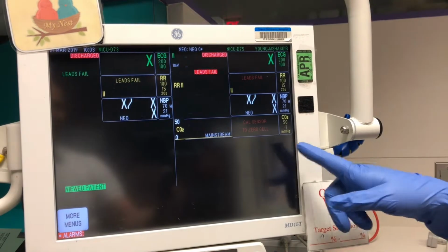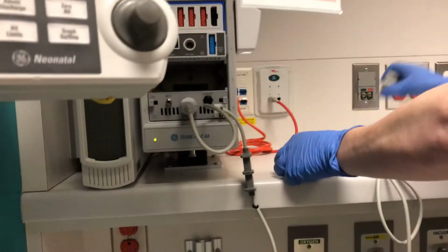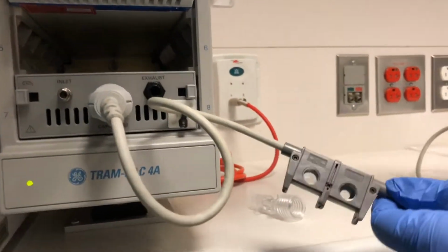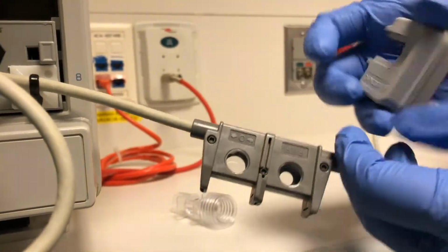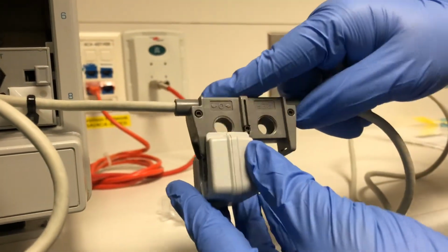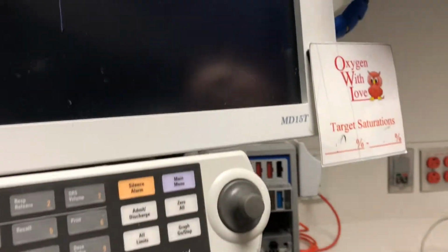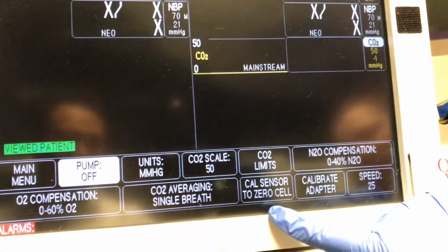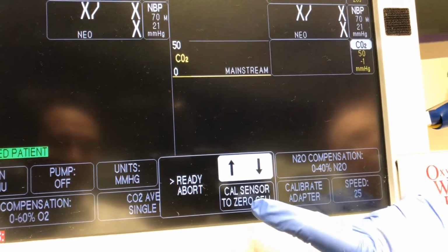Okay, so once it says cal sensor to 0 cell, you're going to take down here. There's two different holes. One says 0 up at the top and the other one says reference. So you're going to take your adapter and slide it in to the one that says 0 first. And then once you do that, you have to come up to the monitor, press where it says CO2, and then you need to do the cal sensor to 0 cell. You'll press it once, and then you'll press it again.